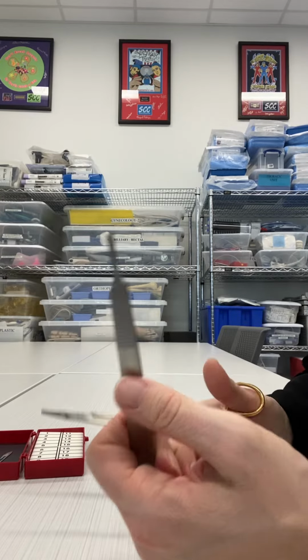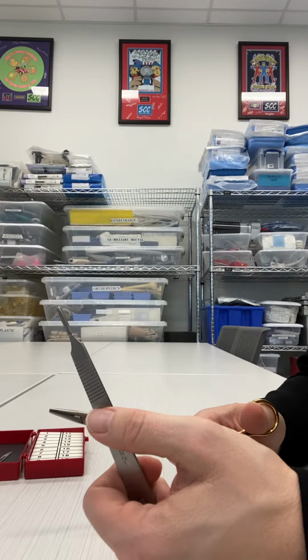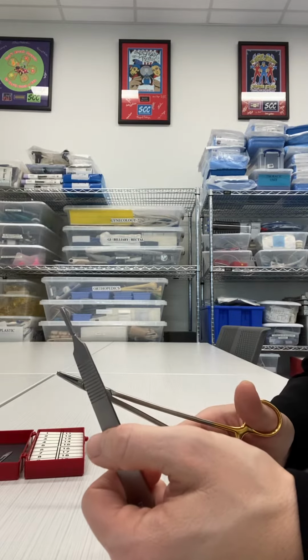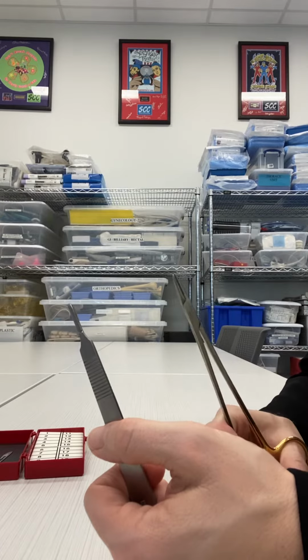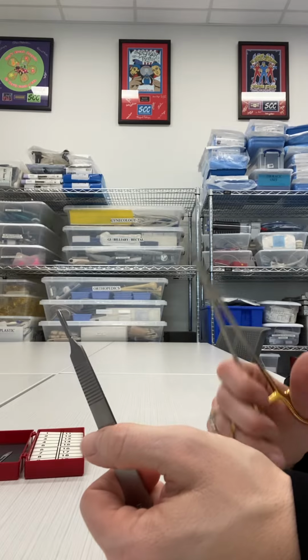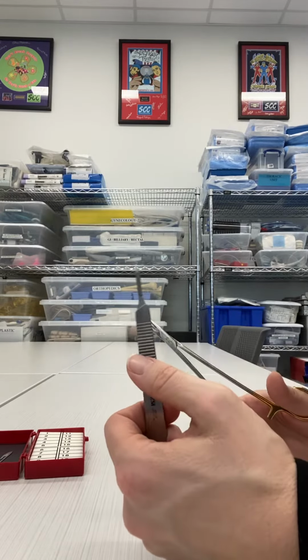You need to make sure that you are loading the appropriate blade on the appropriate handle. Remember that number 11, number 12, number 15, and number 10 fit on a number 3. Number 20 fits on a number 4 handle. The same size blades fit on a number 7 as fit on a number 3 handle. So I have a number 3 handle and I'm going to be loading a number 10 blade.